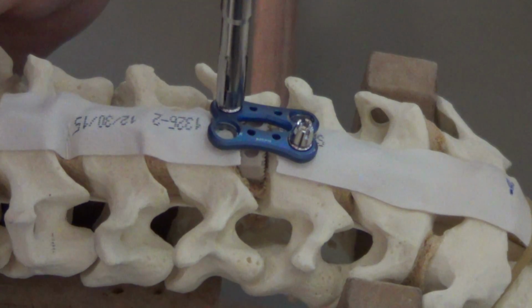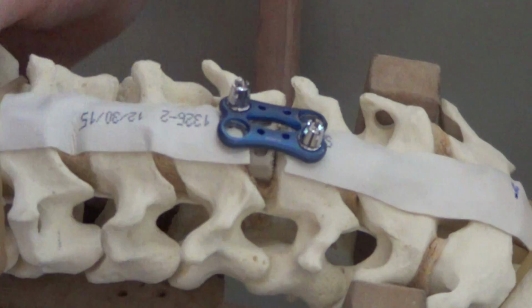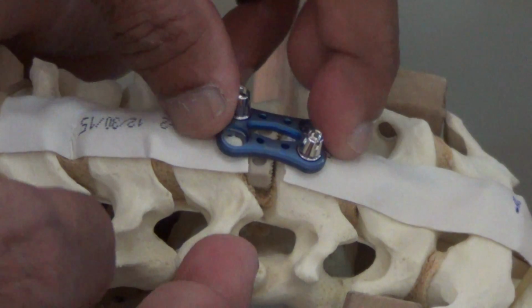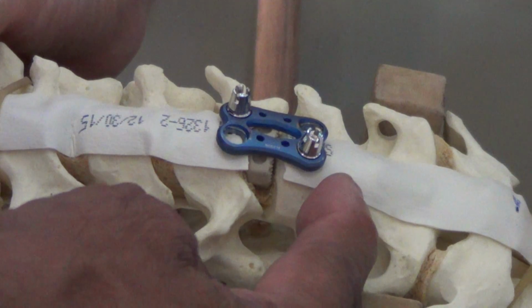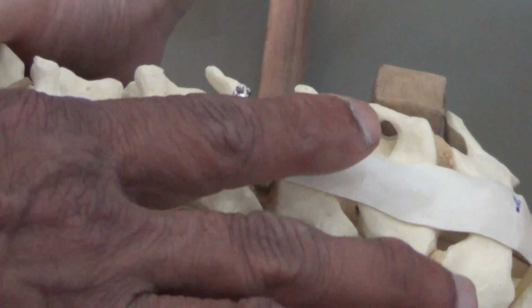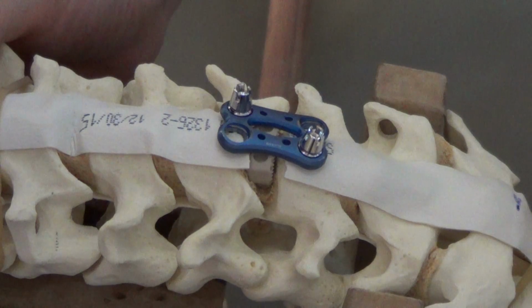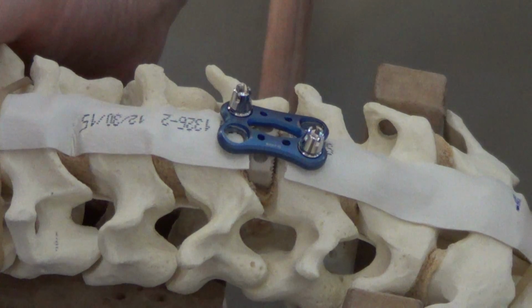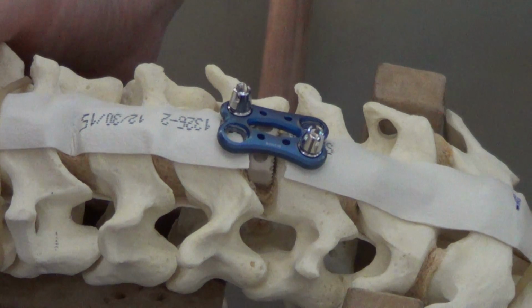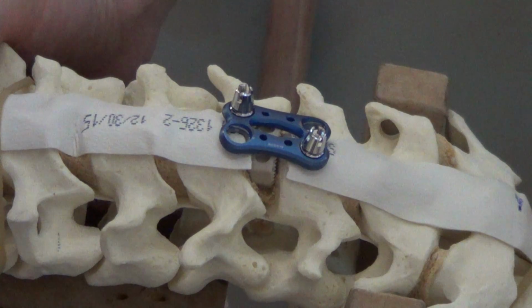Once you have put this pin, you take an X-ray. You do an AP to see that the alignment of the plate is in the center, and also a lateral to see that the pin is in the vertebral body, not too near to the disc above or disc below. Once you are happy with the pin in the AP and lateral view, then you put your screws. Now, what is the size of screw? Usually the size comes either 14, 16 or 18 millimeters. And in your pre-operative MRI or CT scan, you can find out how much it is.